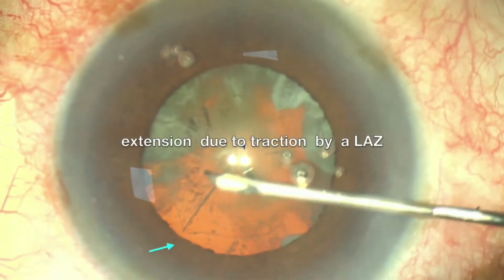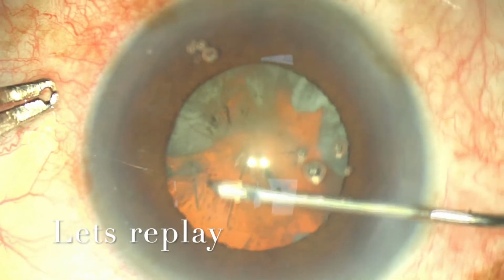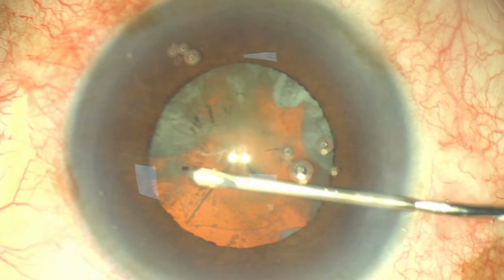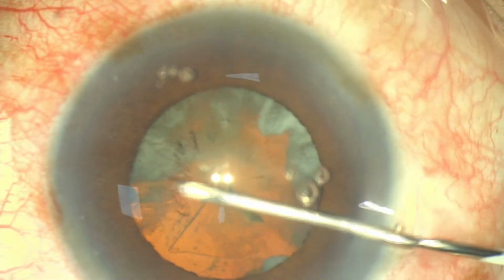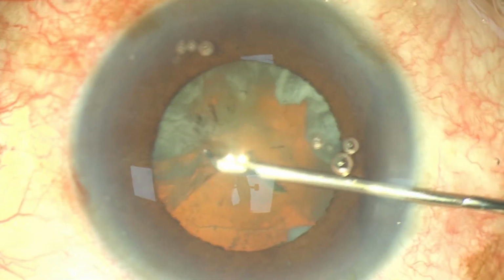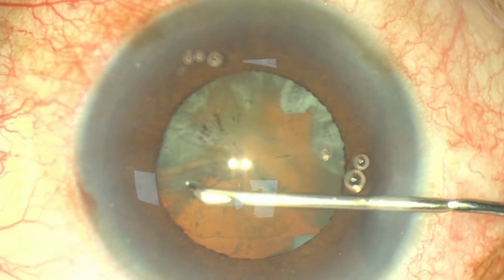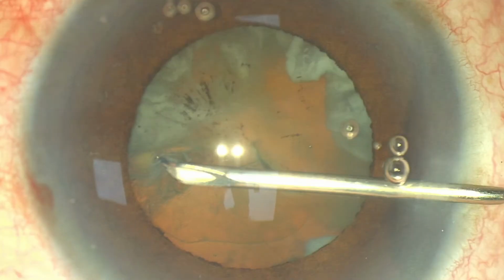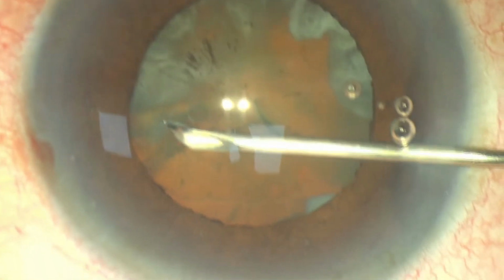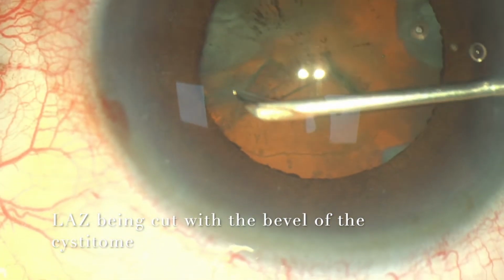A slight extension is noted due to the pull of the long anterior zonule. It is cut using the cystotome bevel.